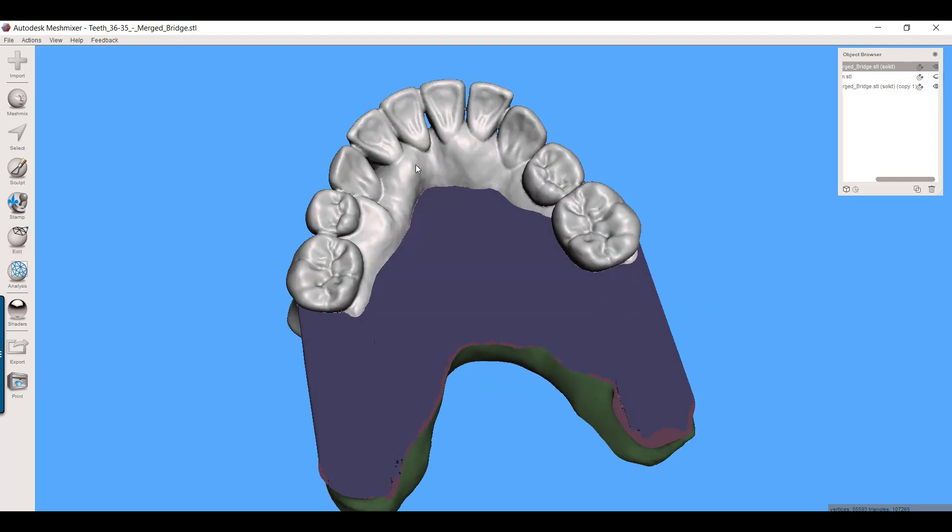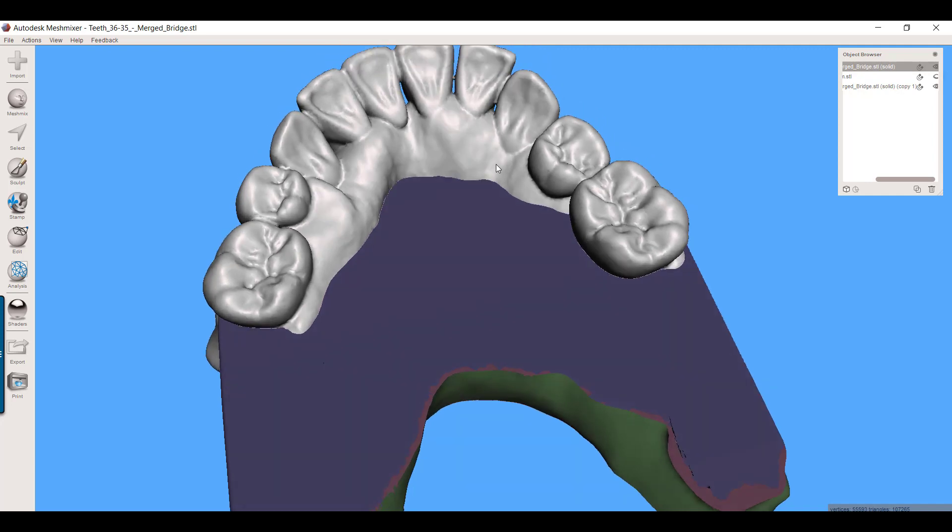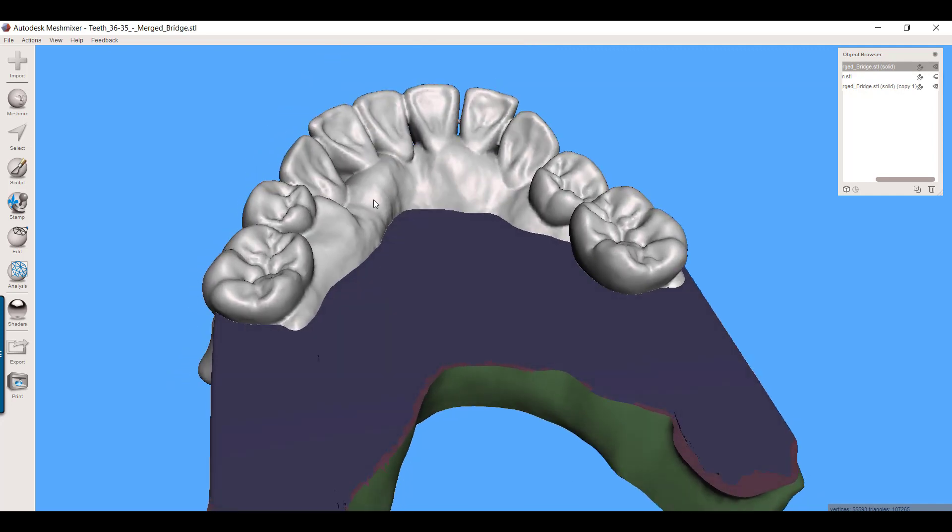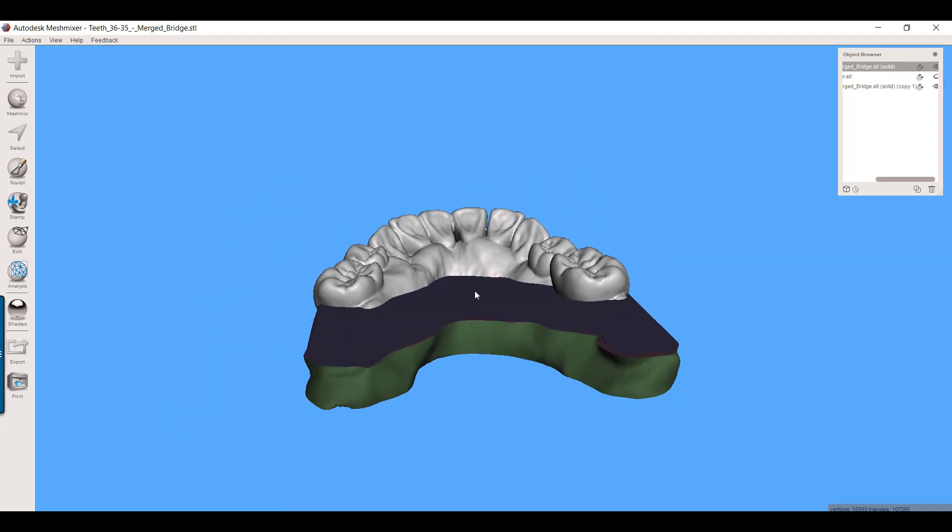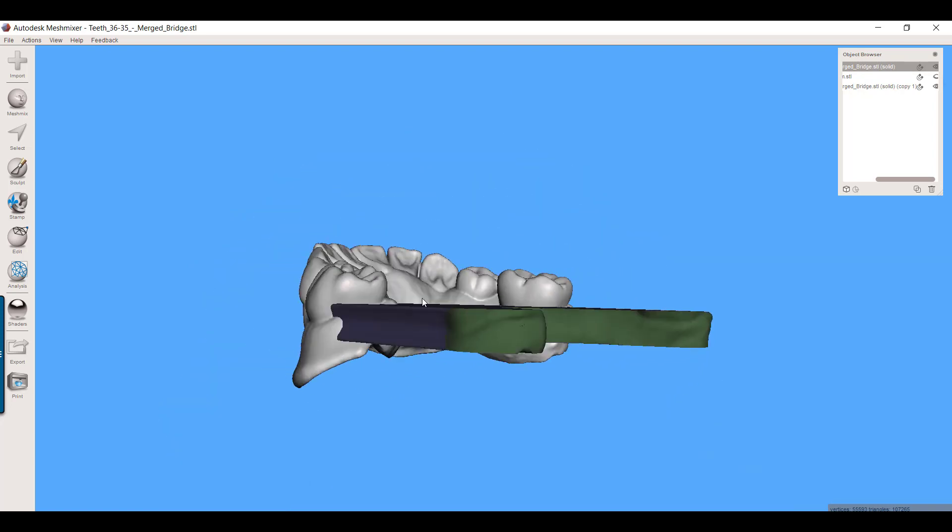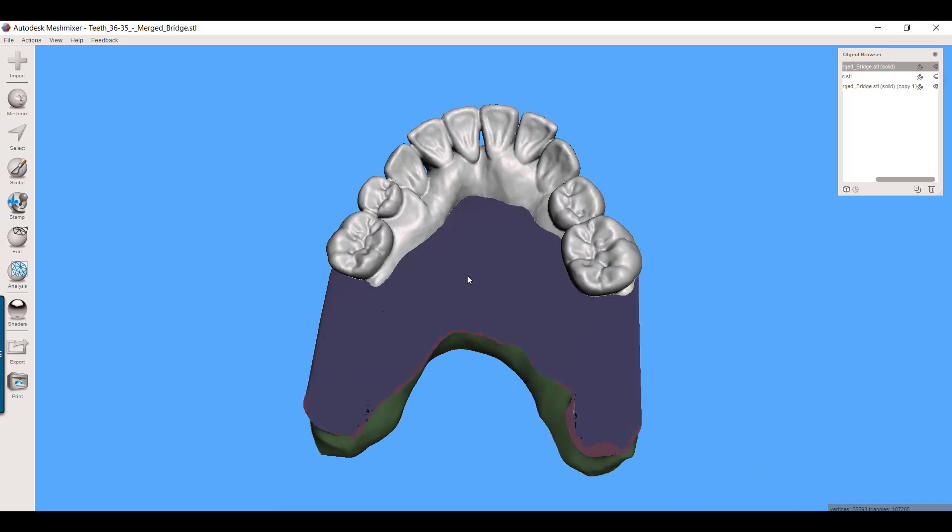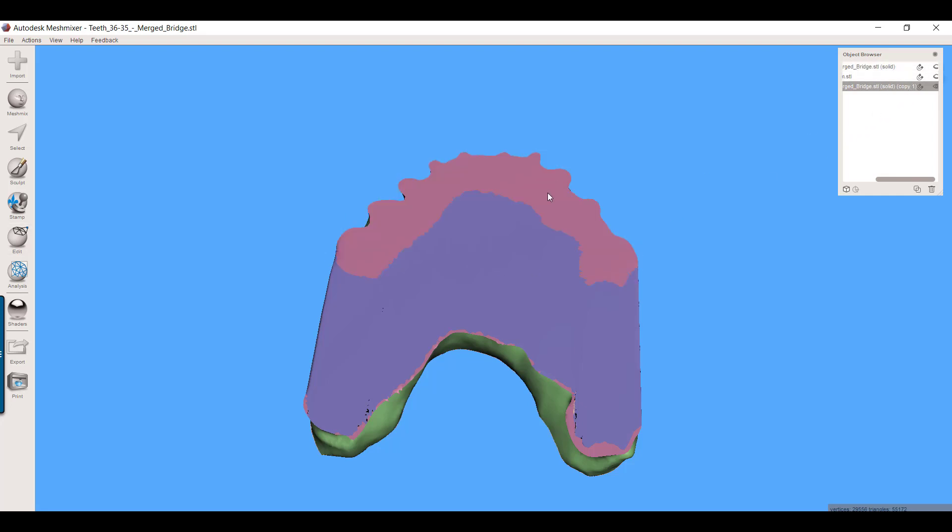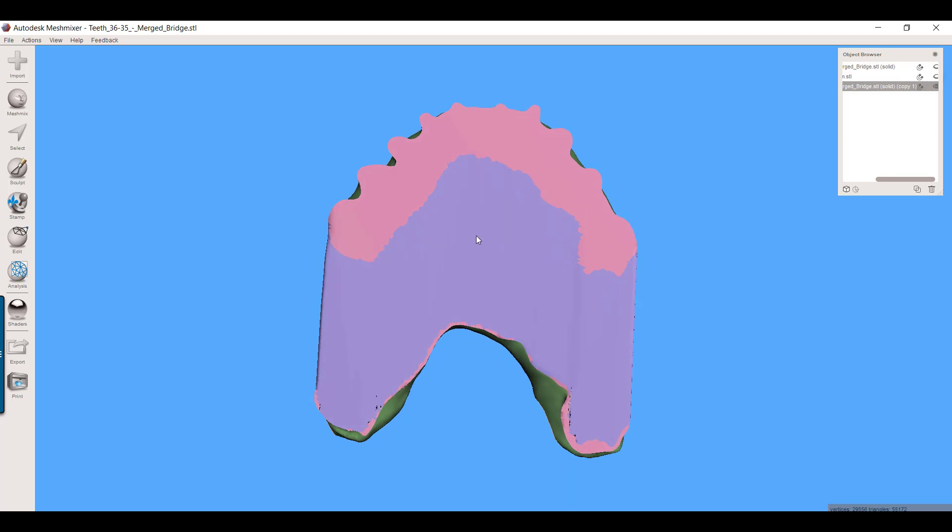So you're going to print two things. You're going to print the temporary in something like Crown and Bridge MFH. If you use our software, you might can do all the gum in pink and the white in tooth colored. However you want to go about doing that, that's fine. But you're going to print this object, and then you're going to also print this object in whatever material, gray, whatever. You just use this as a template. You'll print off the temp, and then you'll print this object. This is going to get laid over the top of that Trilor arch bar.